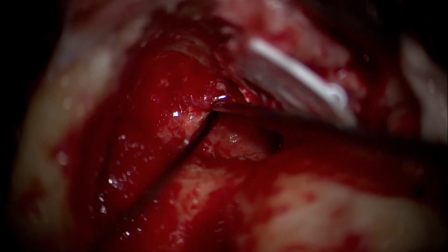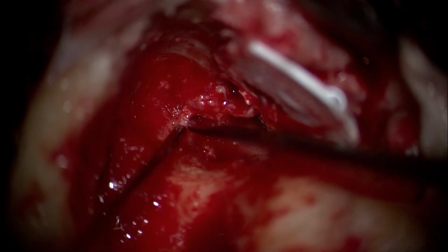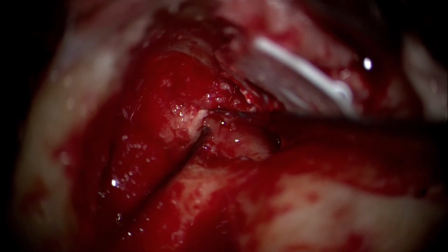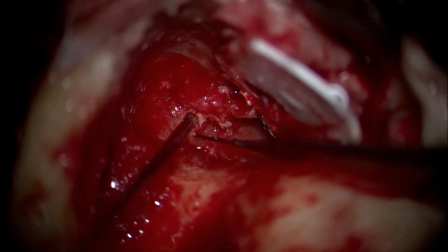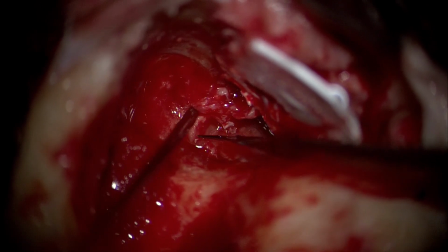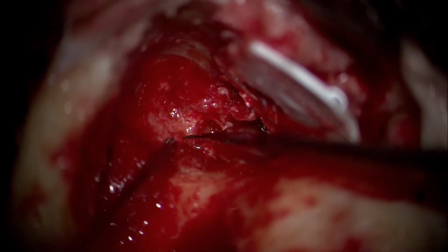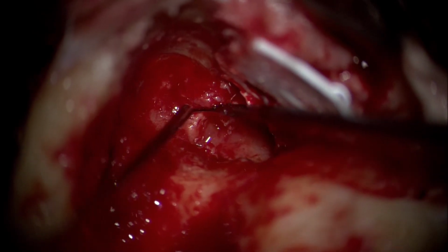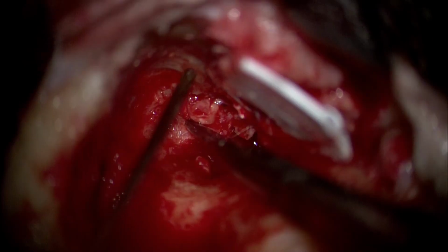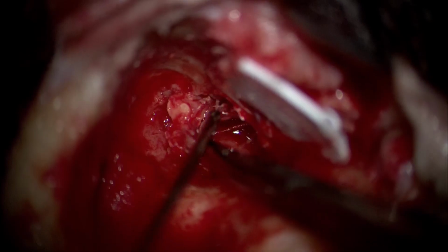especially given the fact that the patient already has close to a non-usable ear. So I think radicality here is important in ensuring disease clearance. If for some reason one feels that it is impossible to clear disease from this, I don't think one should shy away from resecting the stapes while preserving the footplate using sharp scissors. You can see we are also trying to be sure that all epithelium over the processus cochleariformis and the facial nerve region is completely removed and not present anymore. The anterior epitympanic recess is now broadly and widely open.